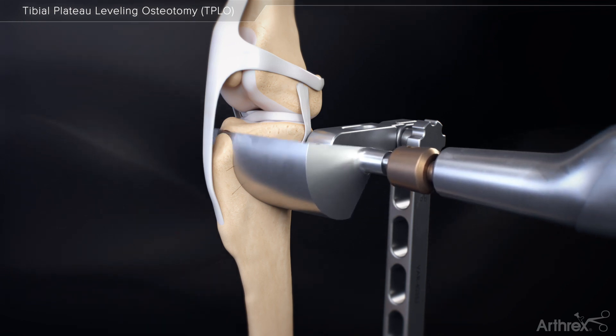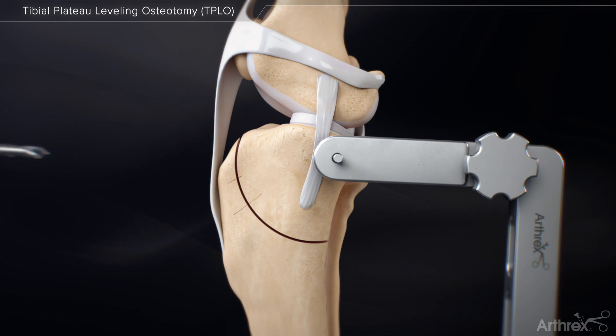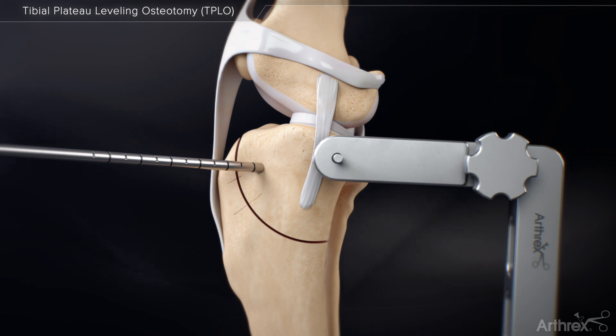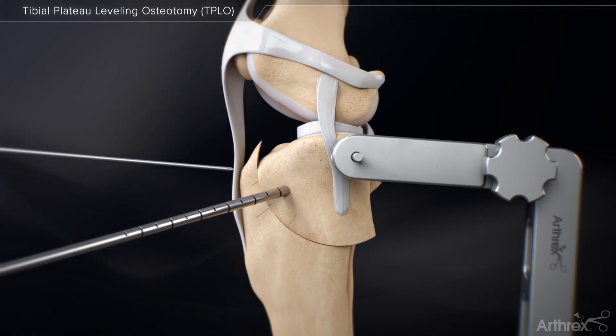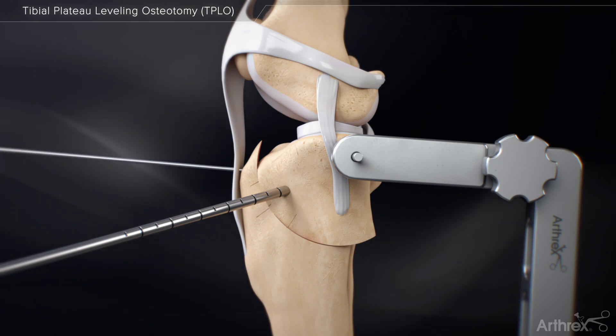Perform the tibial plateau osteotomy using the original score mark. Insert a K-wire rotational pin into the proximal bone fragment through the far cortex at an oblique angle above the level of the patellar tendon insertion. Aim the pin to avoid the articular surface and osteotomy below the jig pin. Rotate the proximal bone fragment until the marks align and secure it in its rotated position using a K-wire through the tibial tuberosity.